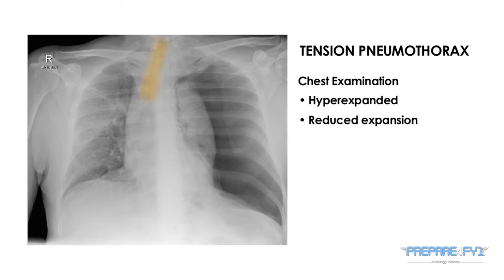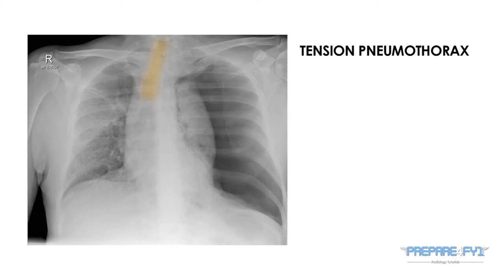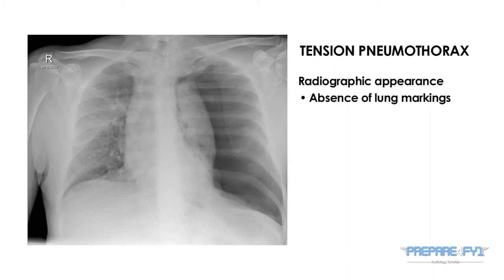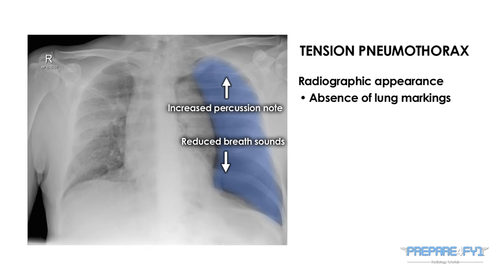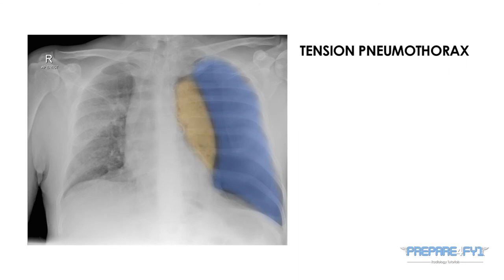This condition causes mediastinal shift. Looking at the radiograph, you can see on the side of the pneumothorax there is a complete absence of lung markings. We have matched this with the clinical findings of increased percussion note and reduced breath sounds. Pressed up against the left heart border, we have outlined the collapsed lung.